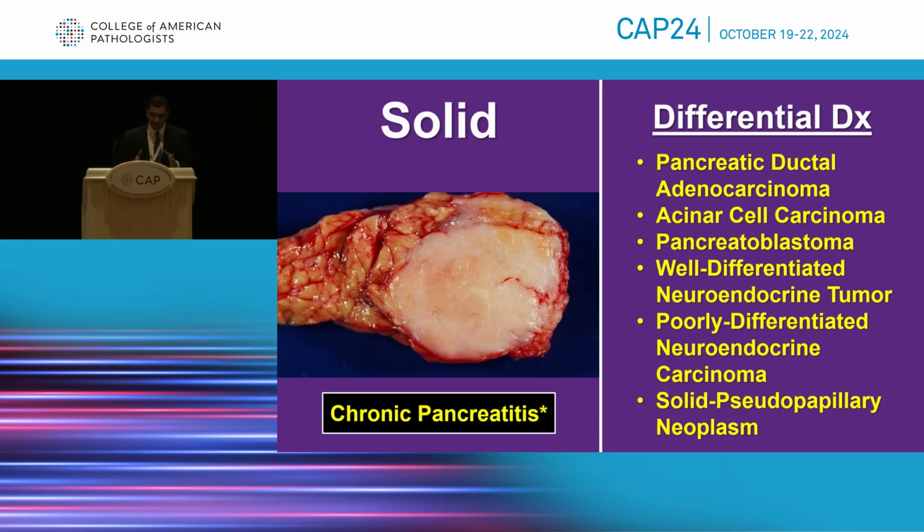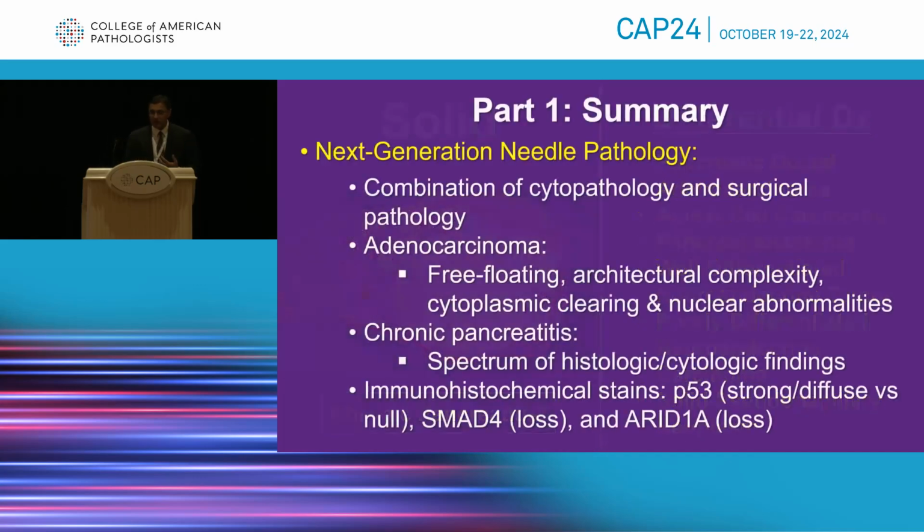So I've gone through a lot, and my time is fleeting, and I want to give Chris his time. Armed with the information that we have when it comes to solid lesions, it's really important to keep in the back of your mind morphology, immunostains, and non-molecular testing. It's really going to be helpful in understanding the molecular genetics and surrogate markers that we're using.